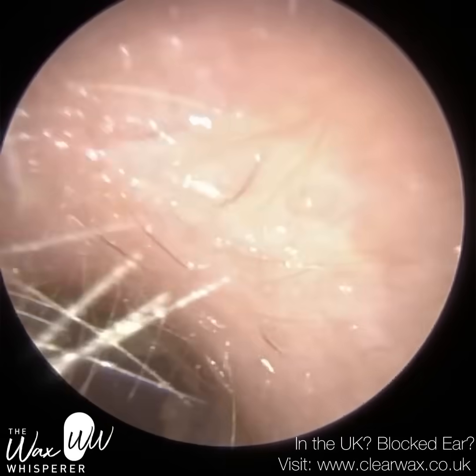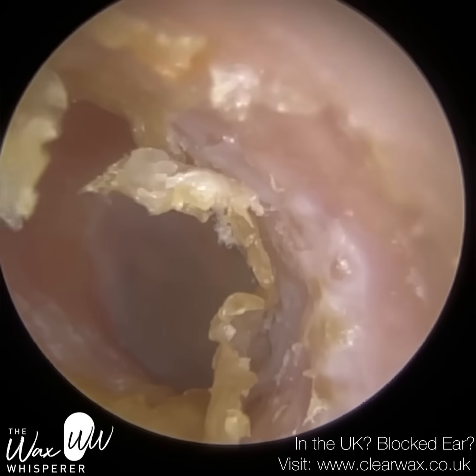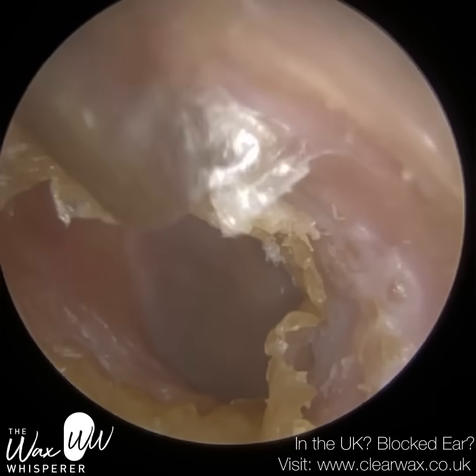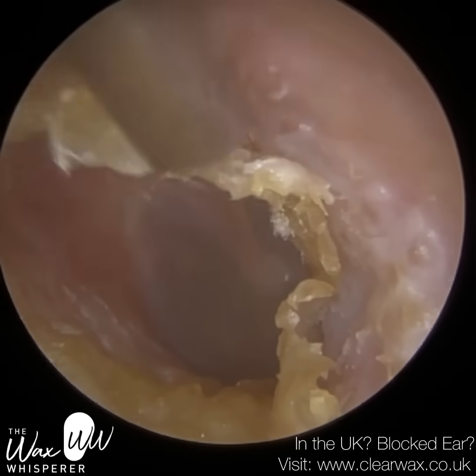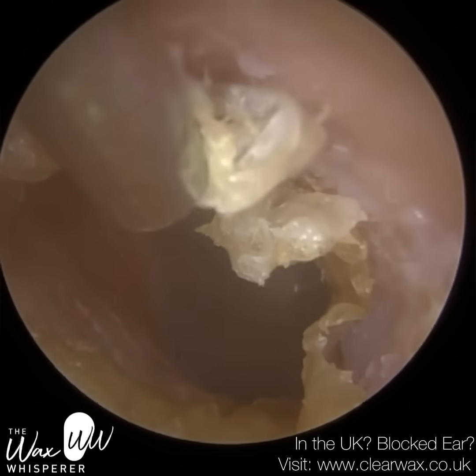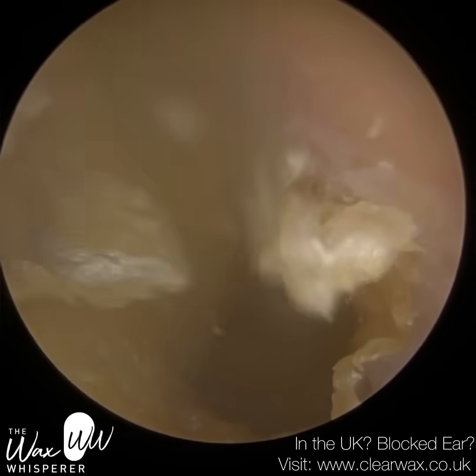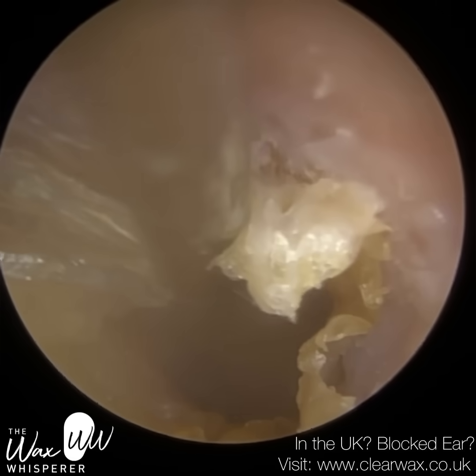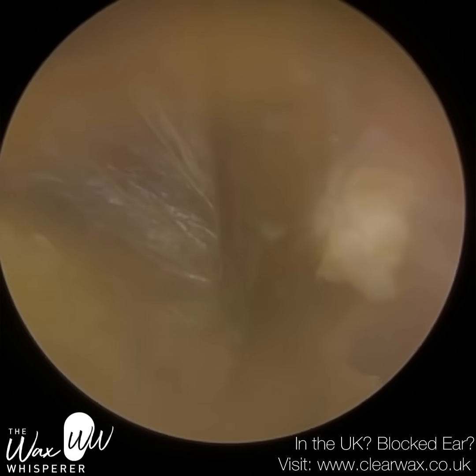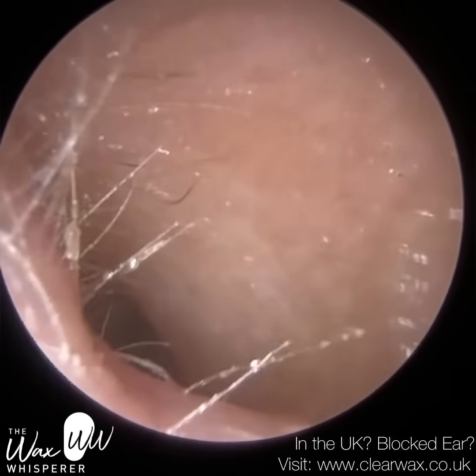Whenever you see a video, it's not just the ear canal. If this was an ear model — what I use in my training course, a mannequin — we can be quite aggressive to remove it because it's not going to cause any pain. But when you've got a live patient, my number one priority is to minimize any discomfort. Some of the things that are possible with a model ear are not possible with a real ear, because it can cause pain and discomfort.